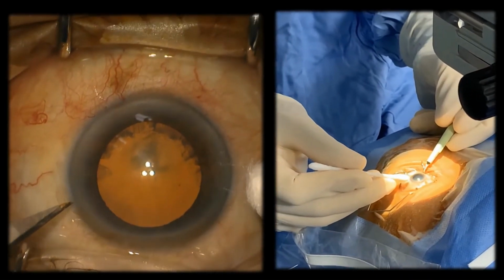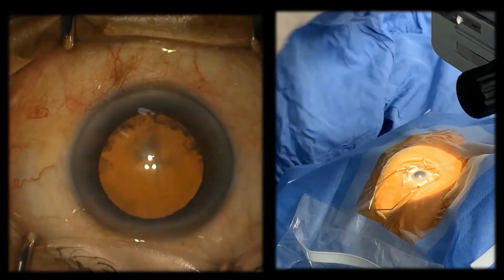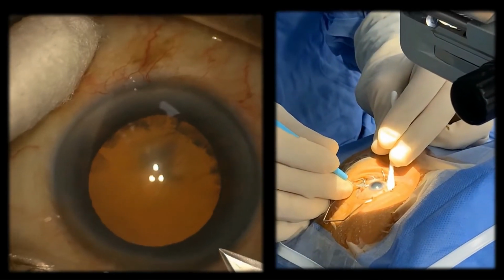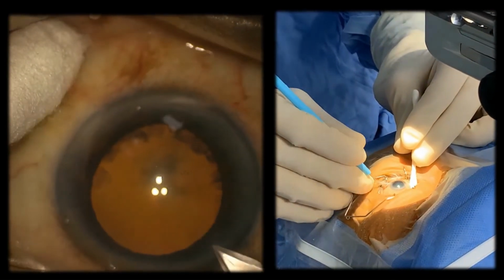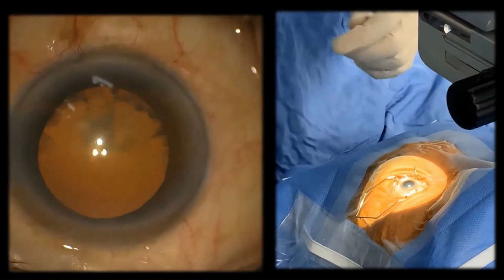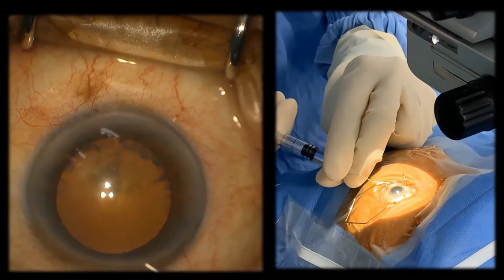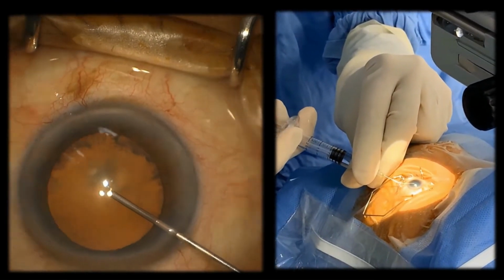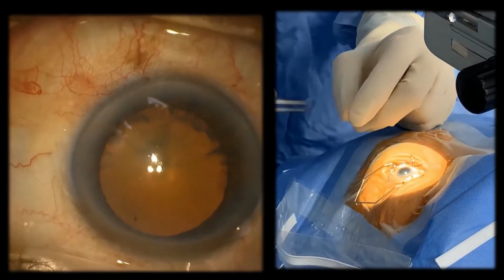Let's start with the right eye. The surgeon is seated at the superior aspect of the patient. A paracentesis is made between the 1 to 2 o'clock position. The main corneal section is made using a 2.2 mm keratome, anywhere from 11 to 4 o'clock position. I usually prefer to make a single step corneal section.